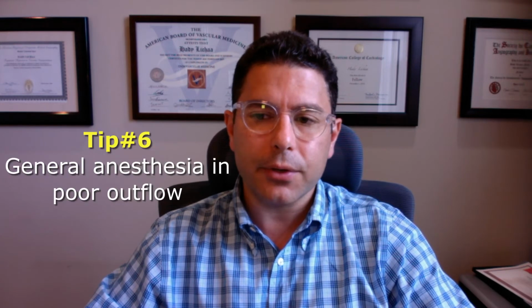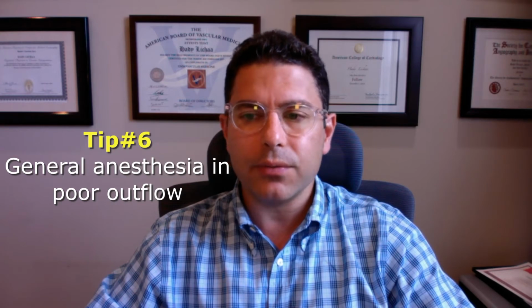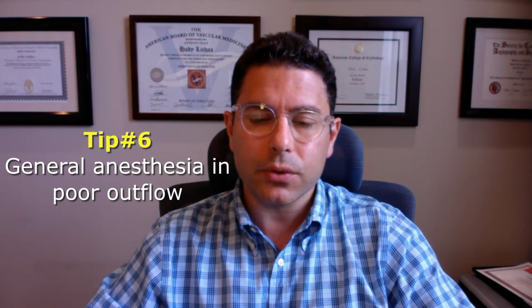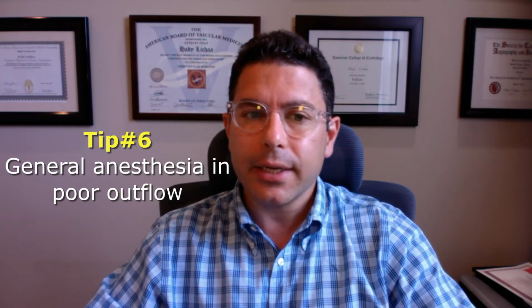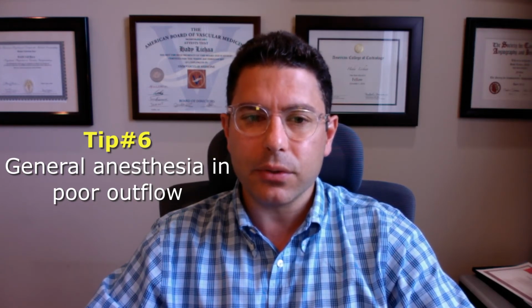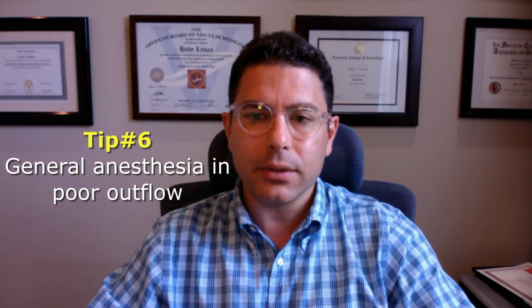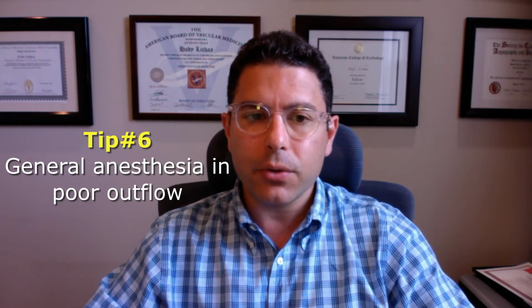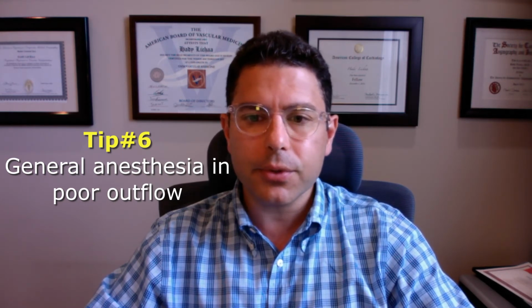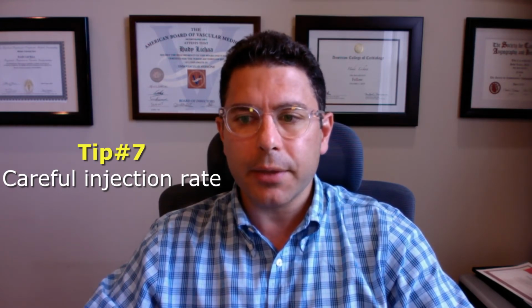Number 6, know very well that patients with limb ischemia who have poor outflow are going to have transient ischemia when you inject CO2, and that hurts quite a bit. So in cases where you think you are going to intervene on infrapopliteal vessels and diffusely diseased vasculature, it will be better to start with general anesthesia so you can have no motion and be able to get DSA images with road mapping.